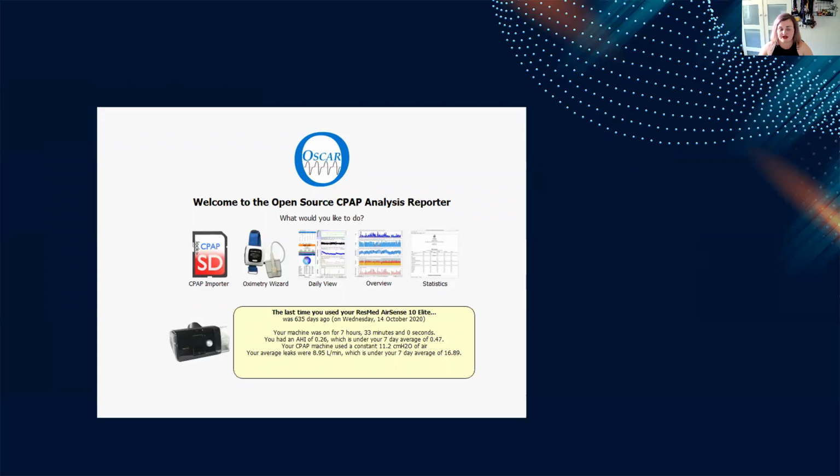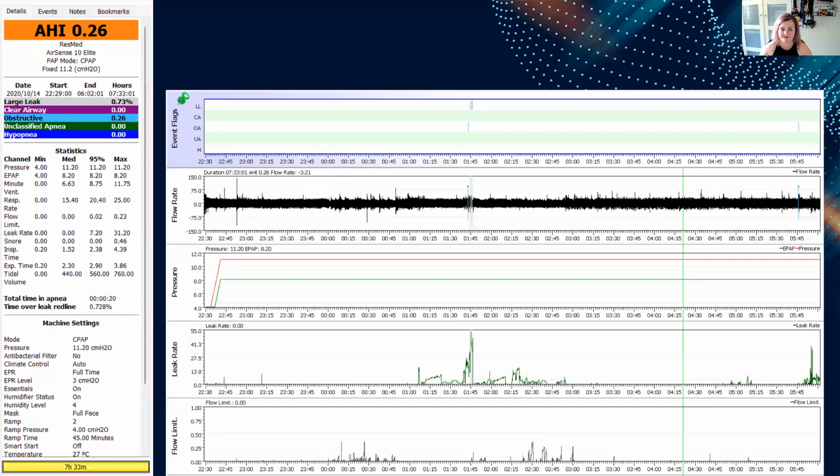Now, OSCAR stands for the Open Source CPAP Analysis Reporter. Now, I had a forensic image, a DD file containing all the information from the SD card, but how this device functions is that you need to plug in the SD card and then it will automatically import the files. So how I got around this little thing is I actually mounted the forensic image as a removable drive and then imported the information into OSCAR to determine whether what I found in the raw data and the digital forensic side of things was actually matching up visually with what was happening.